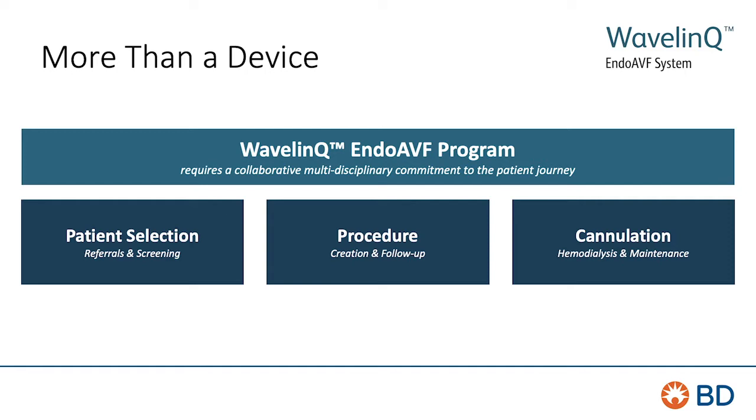It starts with our preoperative screening. Our ultrasonographers really are asked to do a different anatomic study than what they are normally accustomed to in terms of evaluating patients both pre and post AV fistula creation. This is certainly not a standard vein map. Our ultrasonographers have to become familiar with identifying the perforator, measuring the size of the perforator, which is really the crucial part, and then determining whether the ulnar or radial vein is going to have reasonable proximity to the target artery.